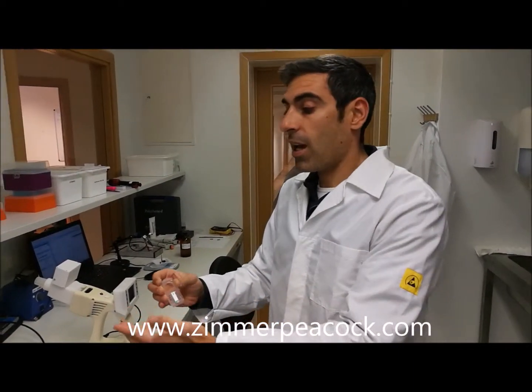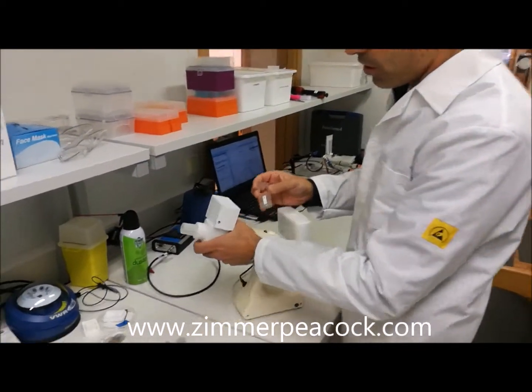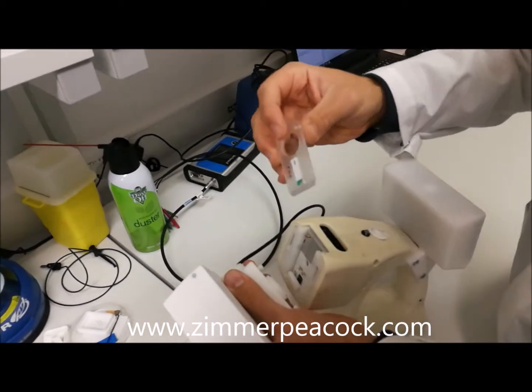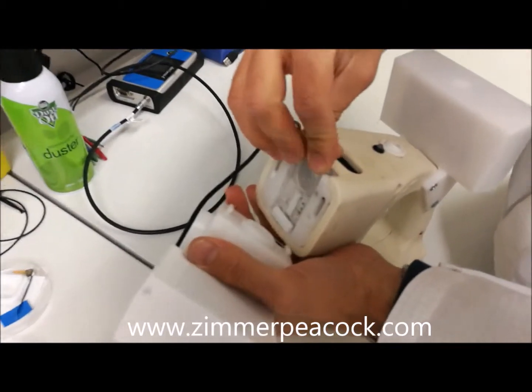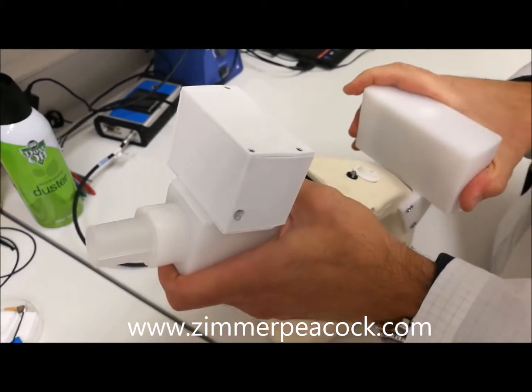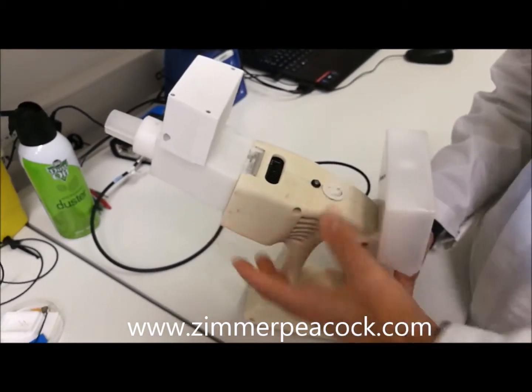We collect about 4 microliters with this cartridge. Importantly, you can pipette from these collection cartridges into other devices and run samples on other devices. Now I'm going to insert the cartridge into its position and put the mouthpiece back together with the valve system.